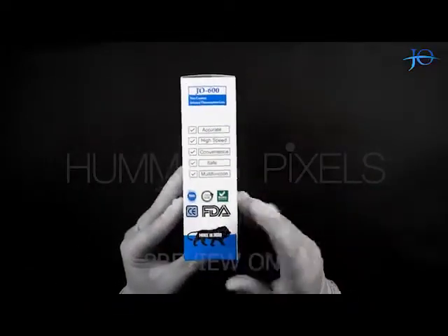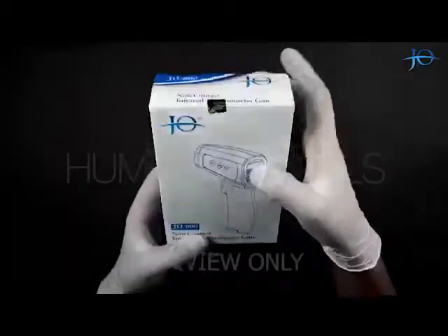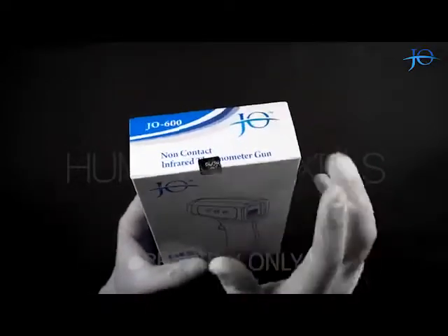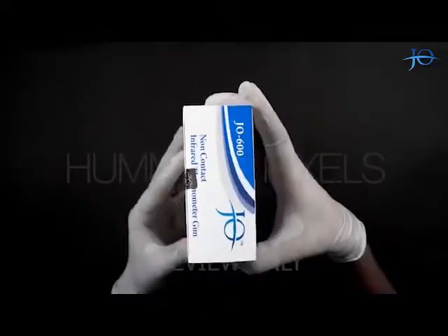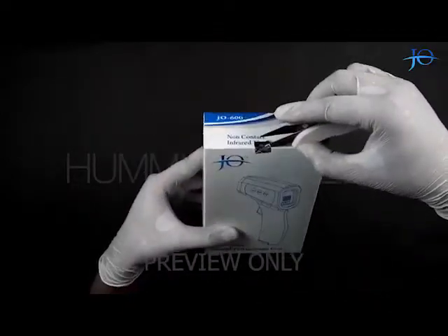It's a Make in India product. The model number of this product is JO-600. As you can see, it has a void seal on the top of the box which has the company name on it along with the manufacturing date, verifying its authenticity. The packaging is very good and has a JO Pharma Private Limited trademark logo on it. Let's get started by breaking the void seal.